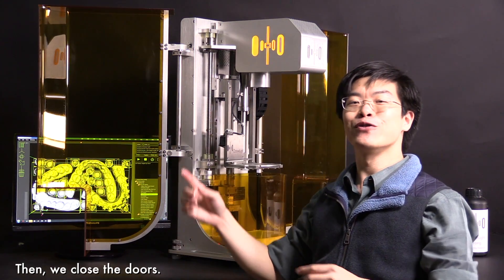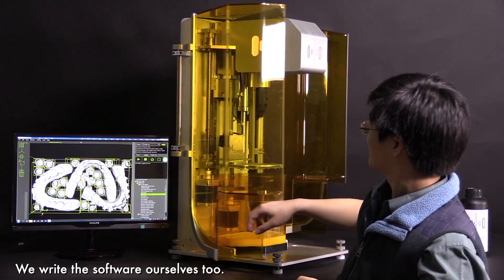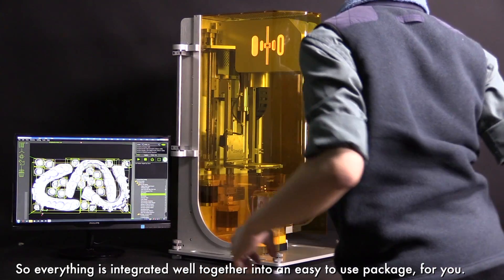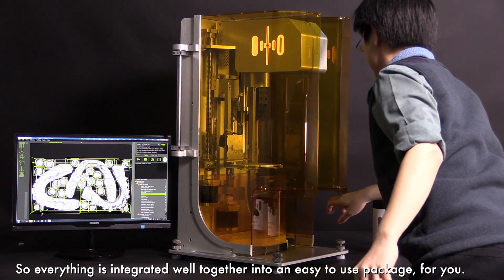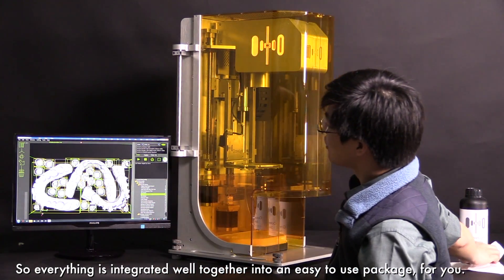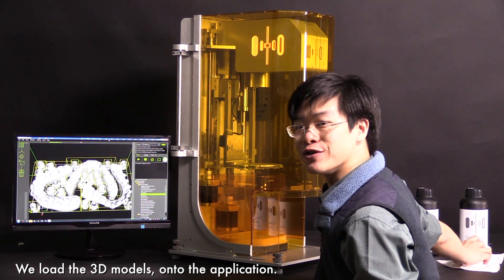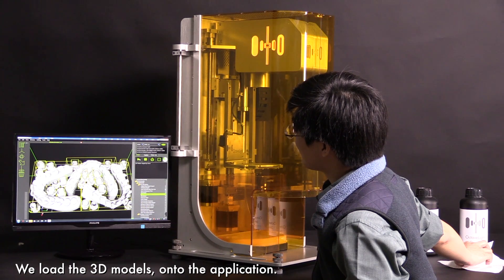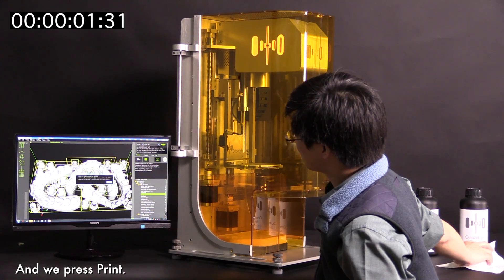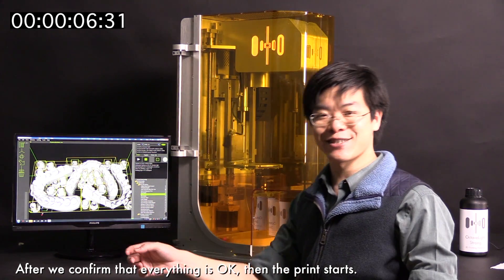First, fix the build plate onto the build platform with two thumb screws. Then we close the doors. We write the software ourselves too, so everything is integrated well together into an easy-to-use package for you. We load the 3D model onto the application and the touchscreen. After we confirm that everything is okay, the printing starts.